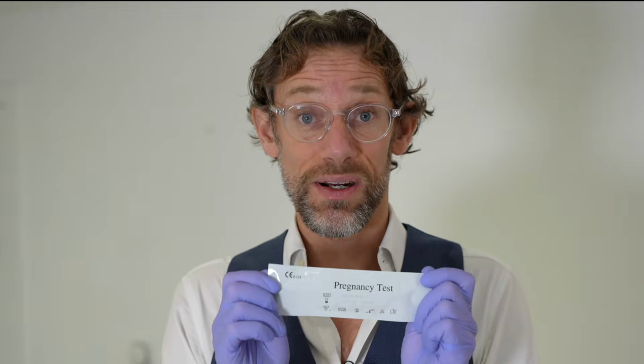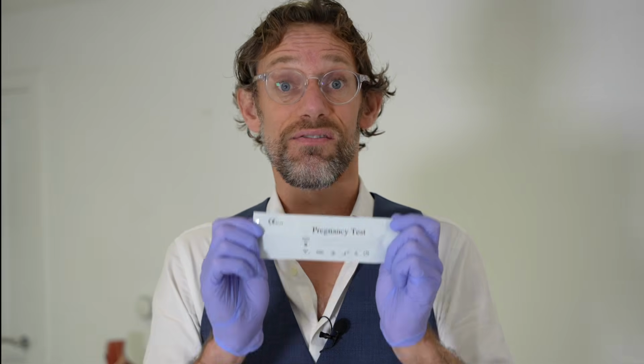Anybody of childbearing age who has abdominal pain really should have a pregnancy test to exclude pregnancy as a potential source of that pain. Now, the pregnancy test is an investigation, it's a test. Therefore, we need to make sure we've got consent before we do so.